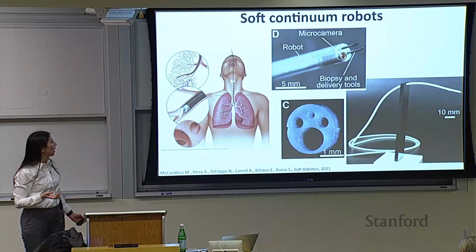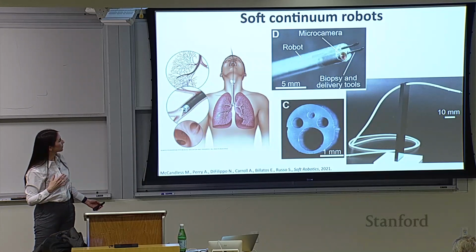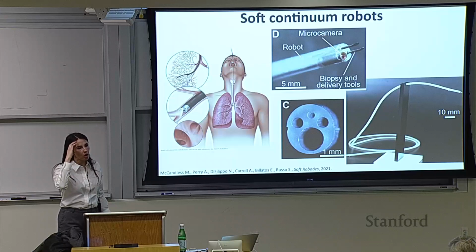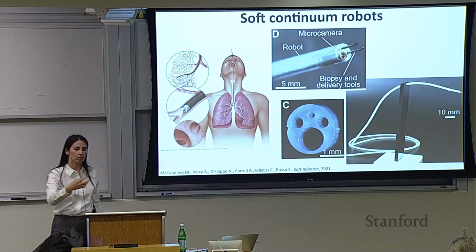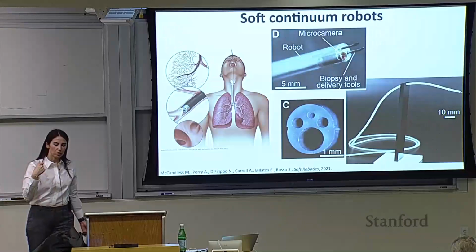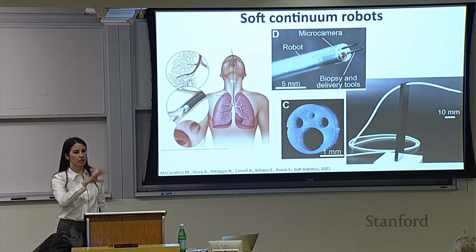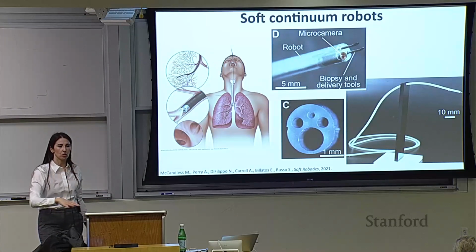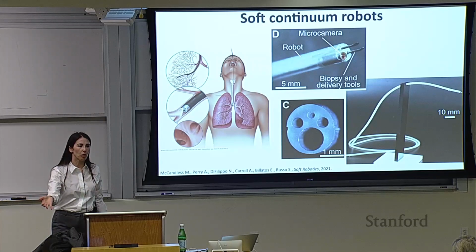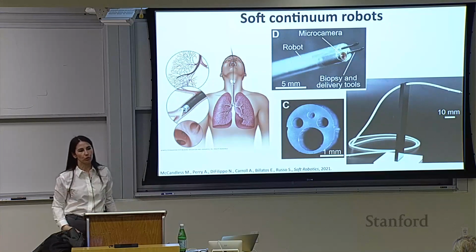With our system, the diameter is almost less than half. That is a good thing, because we hope to proceed further than the 3rd generation on a live animal model without causing that much tissue trauma, because the robot is soft, and hopefully because it's automated, with robotic technology that allows you to steer the robot, propel it forward and see what's going on inside. You should see less tissue trauma as well. We're hoping to assess these capabilities ex vivo first before moving to live animal models, and look at scratches on the explanted tissue, whether or not there has been trauma, before we move forward.